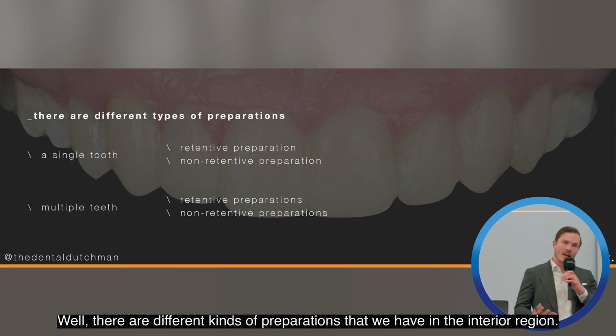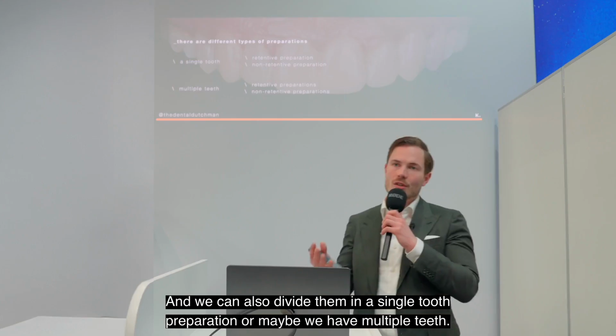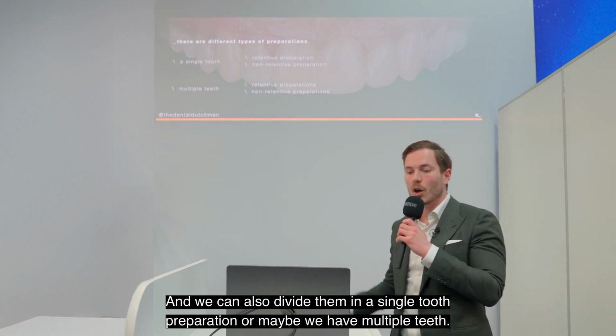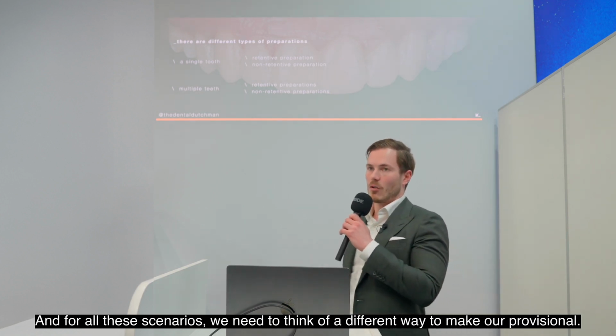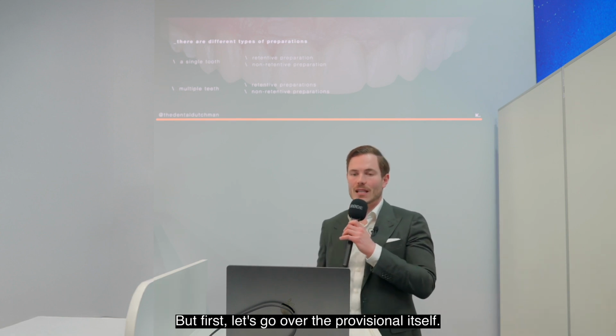Well, there are different kinds of preparations that we have in the anterior region. We have retentive preparations and we have non-retentive preparations. And we can also divide them in a single tooth preparation, or maybe we have multiple teeth. And for all these scenarios, we need to think of a different way to make our provisional. But first, let's go over the provisional itself.